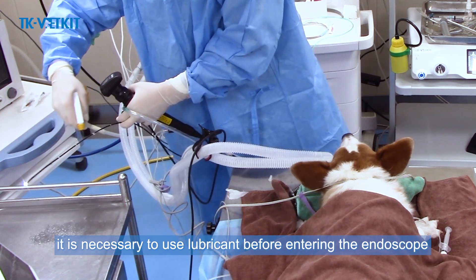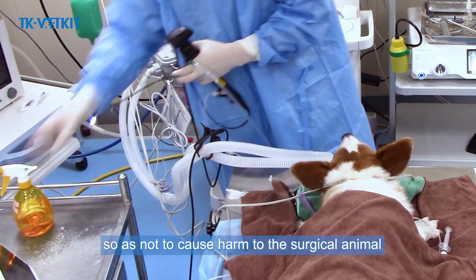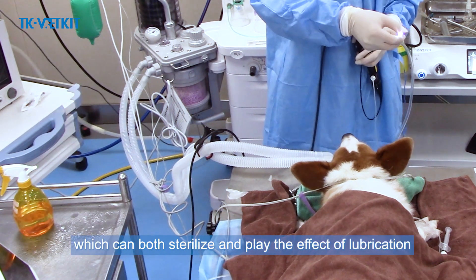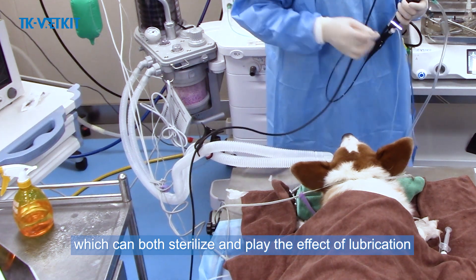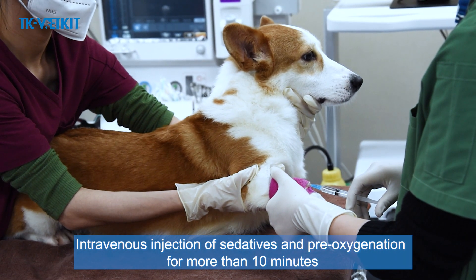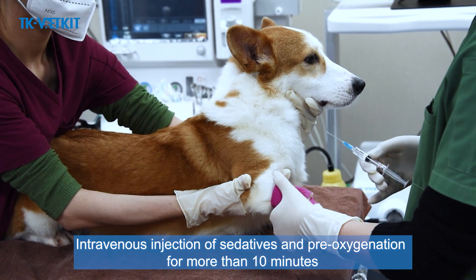This operation uses chlorhexidine, which can both sterilize and provide lubrication. For anesthesia and monitoring, administer intravenous sedatives and pre-oxygenate for more than 10 minutes.